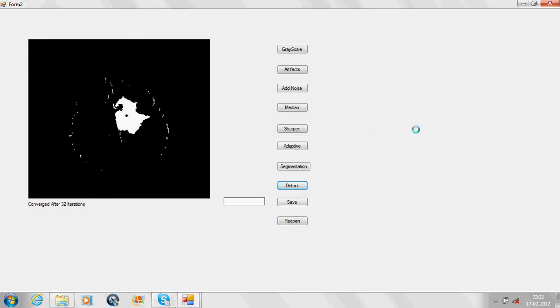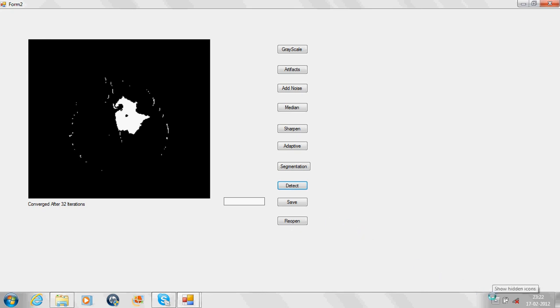These three modules can work for any image of the brain. We have given the save tab for saving the image and reopen tab for reopening the image. This was all about our project. Thank you.